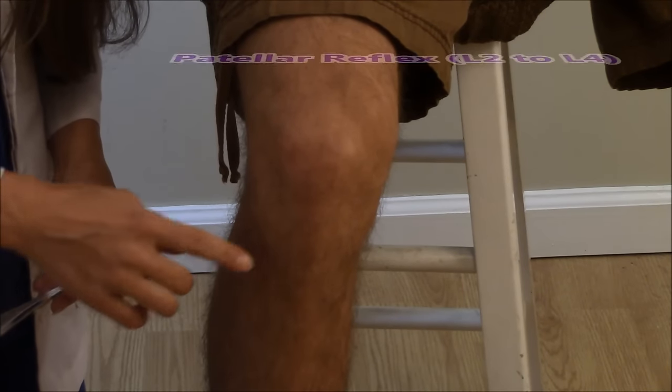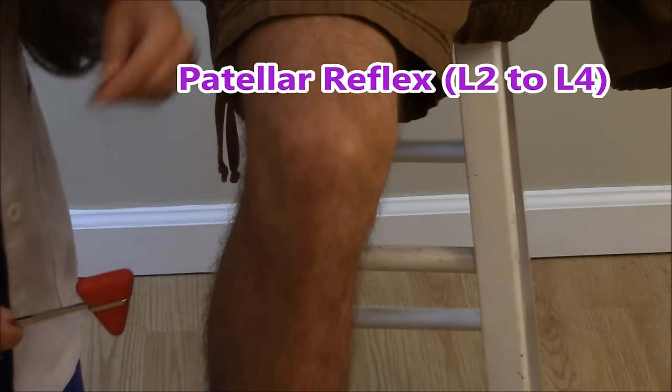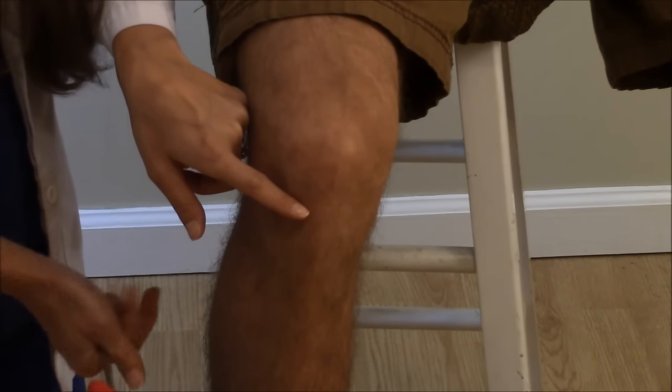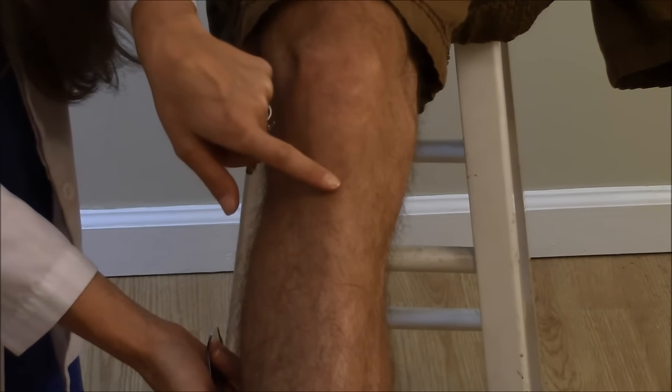To check the patellar reflex, this is going to be looking at L2 to L4. To find the tendon, you want to locate the kneecap and then go just a little bit right below it. The best way is to have the patient extend the leg out and then that tendon will pop out — and that is where you're going to go.